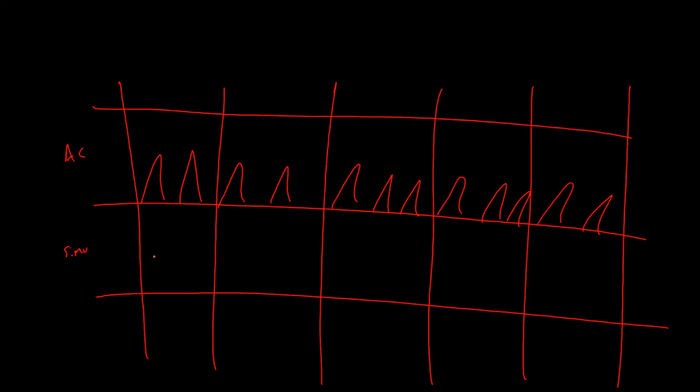Okay, SIMV, what we can do is, let's say we have a respiratory rate equals 12. Well, in SIMV, what if we drop the respiratory rate down, let's say equals 6. So you can see those machine-driven breaths, but now the rest of these are pressure support breaths. Can you see how the patient's doing more work with this?